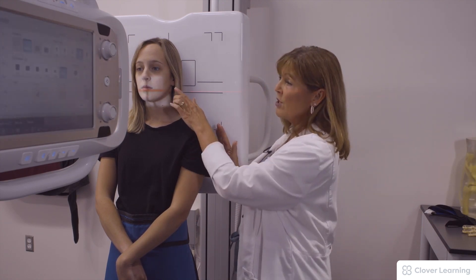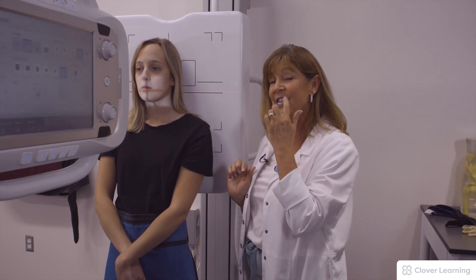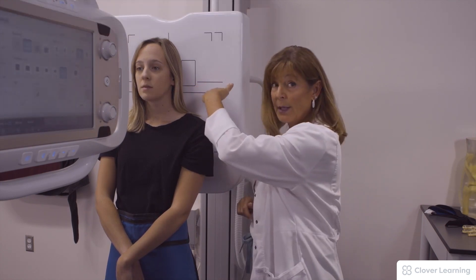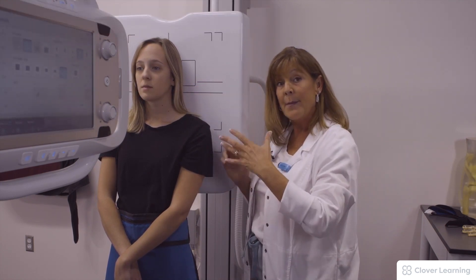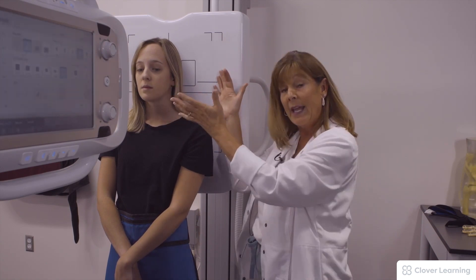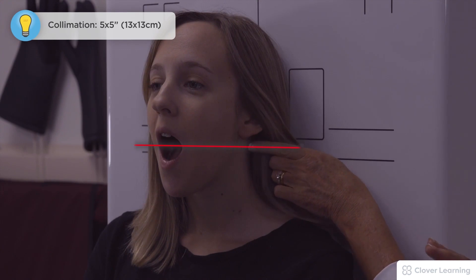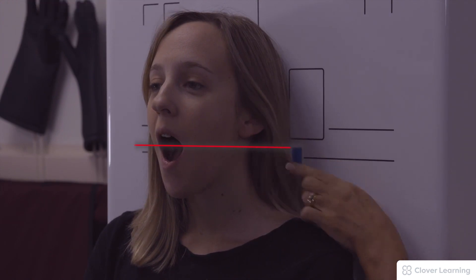I'm going to stand to the side of the patient. When she opens her mouth, the central ray alignment is from the incisor tooth to the mastoid, and that plane must run perpendicular to the IR. Standing to the side allows me to adjust her chin forward or back to ensure that alignment is perpendicular. I'll have her open her mouth really wide and make the adjustment.